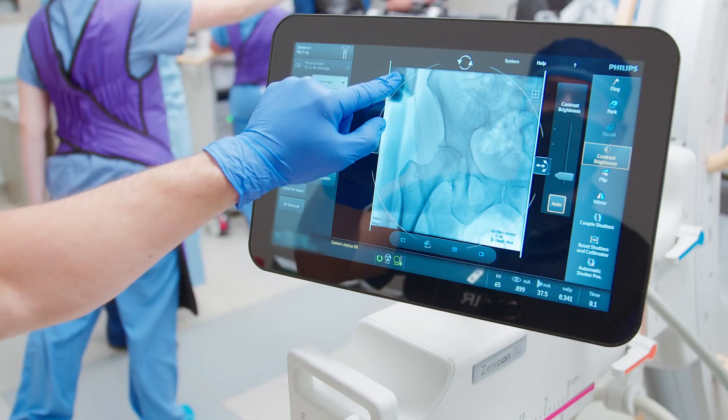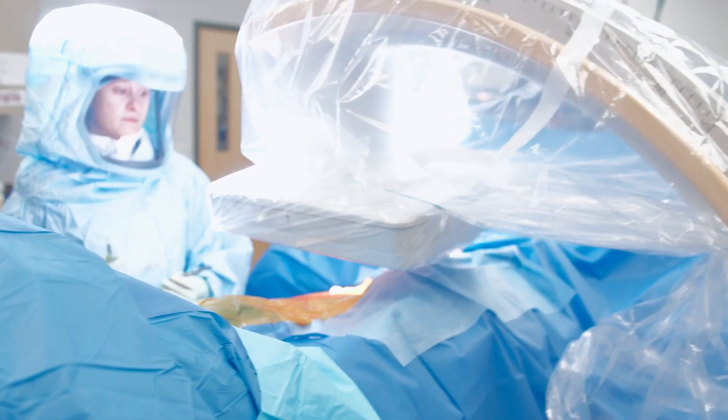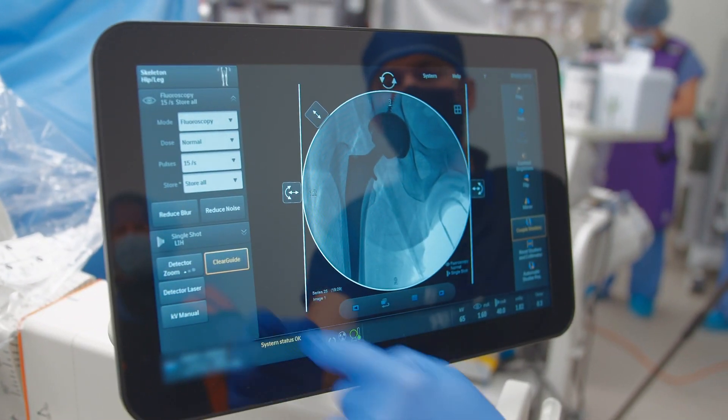The preset and different anatomical settings allow us to utilize the C-arm without a lot of adjustments, to improve efficiency during the case.